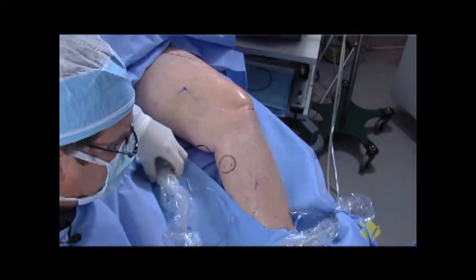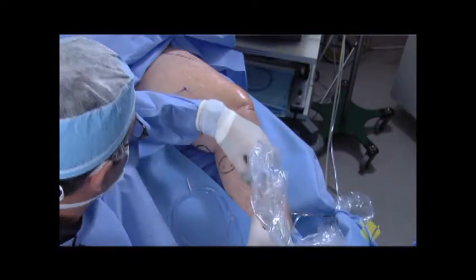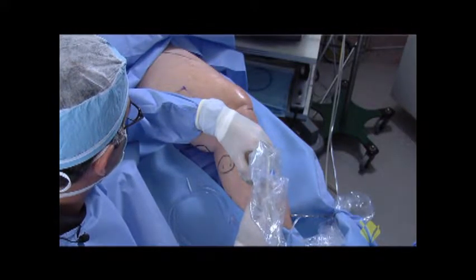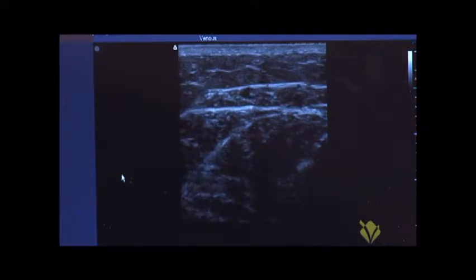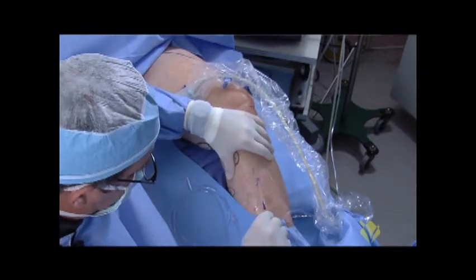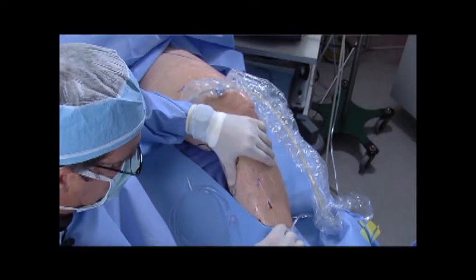With the bevel facing up in your right hand, using your left hand as your ultrasound hand, I'll make sure I feel the wheal where I've numbed it, to confirm I'm not going into an area that hasn't been anesthetized. I'll turn my attention to the screen, and as I see the needle tip denting the anterior wall, I'll apply gentle pressure, then pull the tip back. What you're observing here is just a gentle slow drip of venous blood. The wire should go up pretty smoothly — you can see me squeezing the leg. Without the squeeze it bumped into a side branch, but with it squeezed I was able to negotiate that bend.